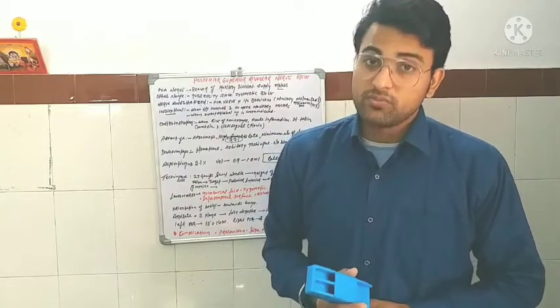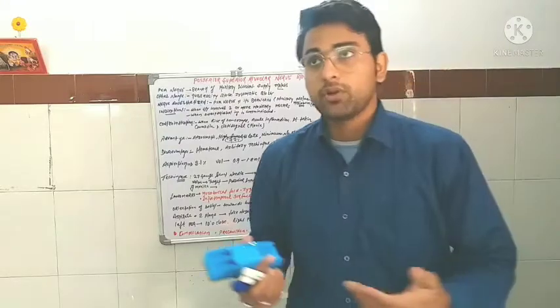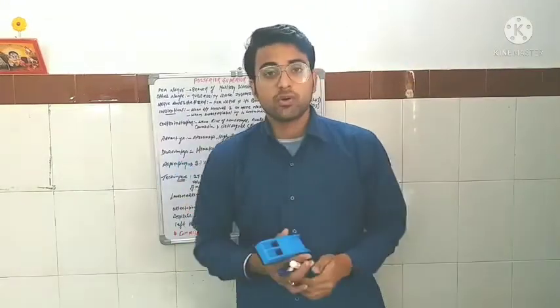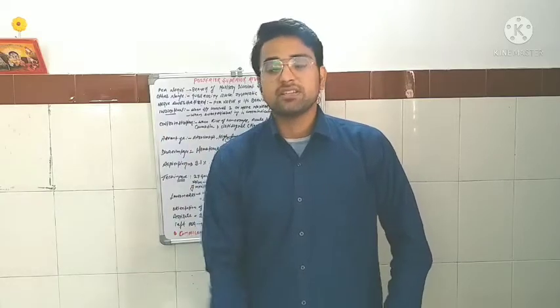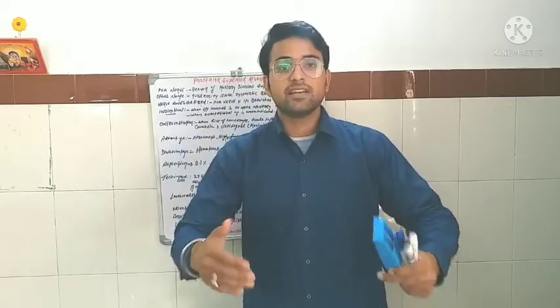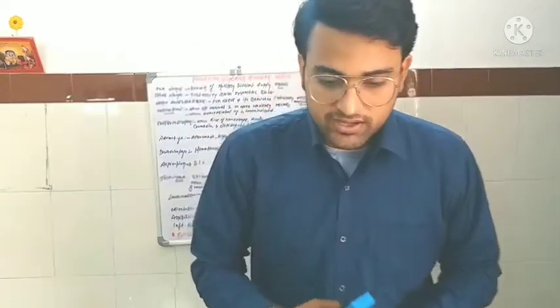Then the precautions. You have to take all the sterilization precautions. Take precautions so that the patient does not go into syncope. If you find that, due to anxiety or stress, the patient is in syncope, just elevate the legs and place the patient in a supine position.